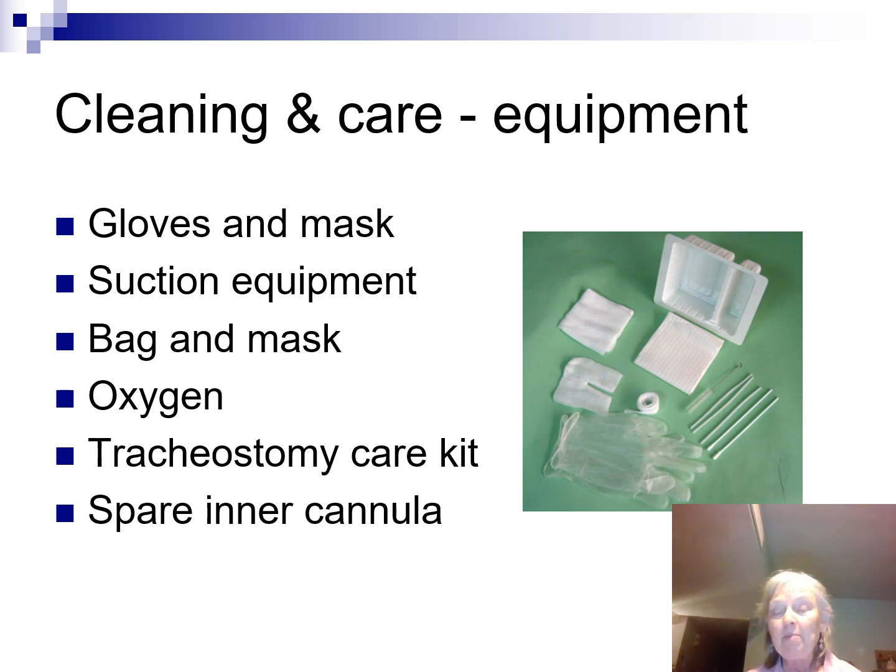Where does this normally happen? You're in the middle of an isolation room doing trach care. You go to grab the inner cannula out of the box and there's nothing in the box. You cannot leave the room because the patient doesn't have their trach in, with all the parts and pieces together. So at that particular point, you're pretty well stuck. You cannot go in the hallway with gloves on. You cannot go out in the hallway with a gown on. Whatever's in the isolation room has to stay in the isolation room.